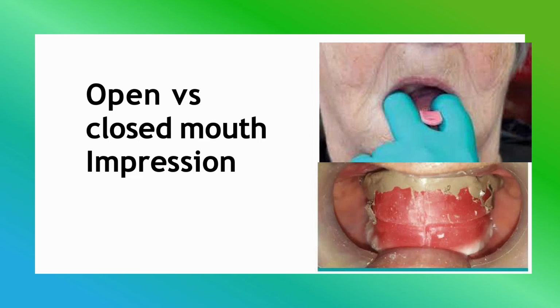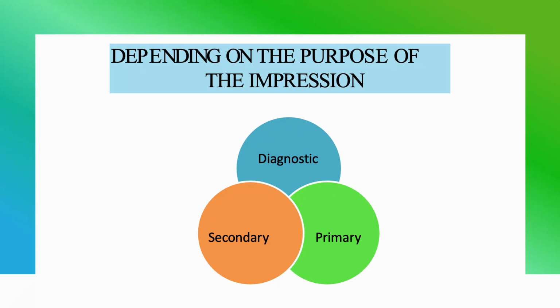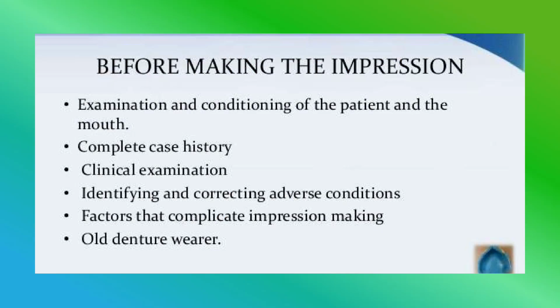Then we have open mouth versus closed mouth impression technique. Depending on the purpose of impressions, impressions can also be classified as diagnostic impressions, secondary and primary impressions.